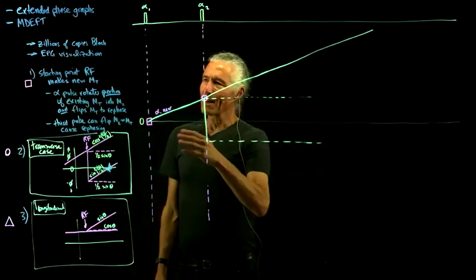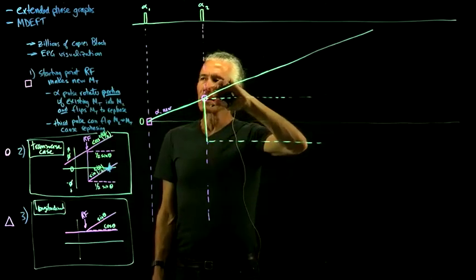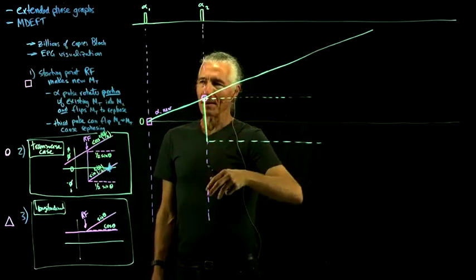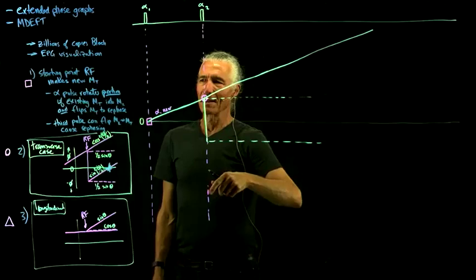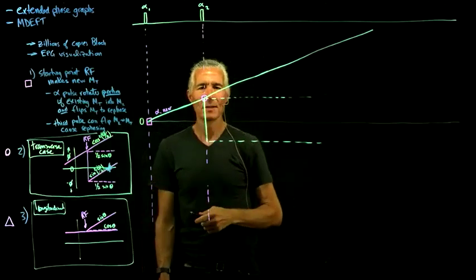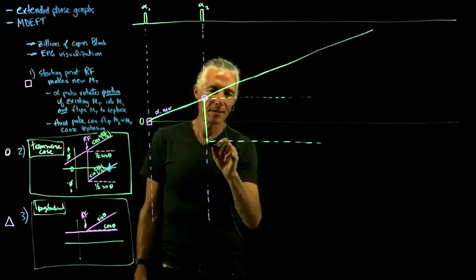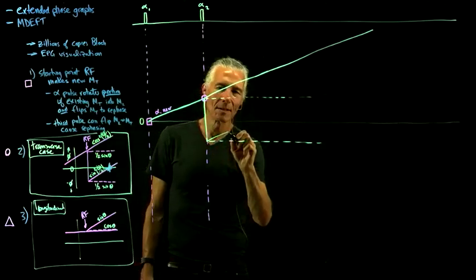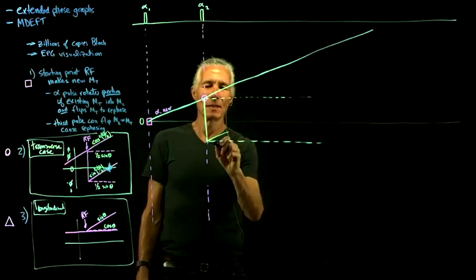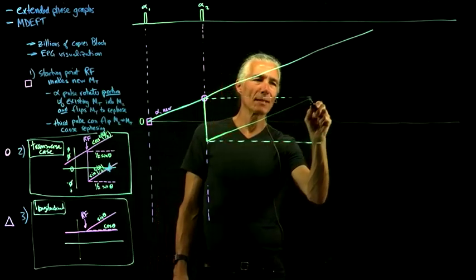Well, all is not lost. You could spread around the circle like 10 times, and if you did an RF pulse, you could then be 10 cycles ahead, and now you're 10 cycles behind, and you'll get an echo. Okay, and then we also cause some additional, which is the one we're really interested in, which is the one that causes the echo.